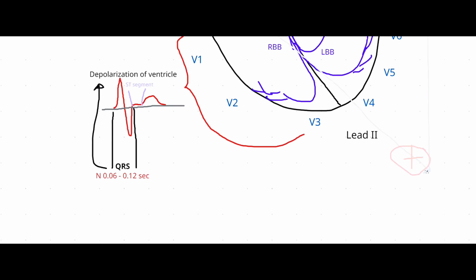So normal T is like that, right? I'll put, so the T is measured in height. Okay, so the T wave. And the T equals the ventricular repolarization, meaning the ventricle is supposed to be resting, right? T wave is supposed to be resting. However, why is it still elevated? Any idea? Why is it not flat?